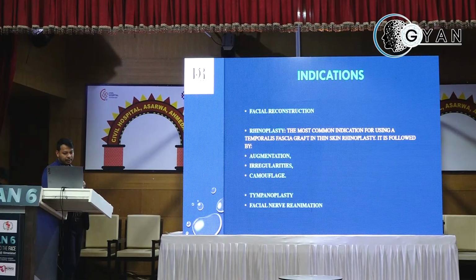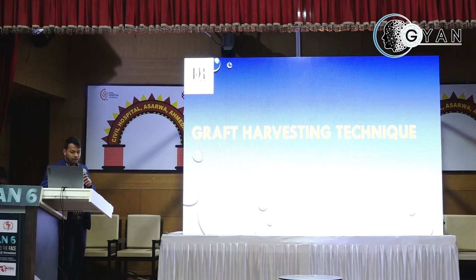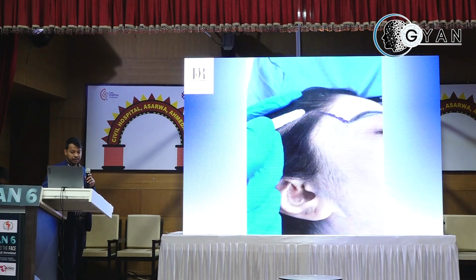It's used in facial reconstruction, again in rhinoplasty, where we use it for augmentation, irregularities and camouflage. Again, in ENT procedures like tympanoplasty, and also you can use it in facial nerve reanimation. So this is a small video of the graft harvesting technique, how I do it on a regular basis.